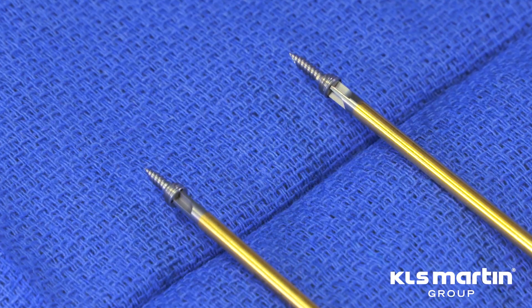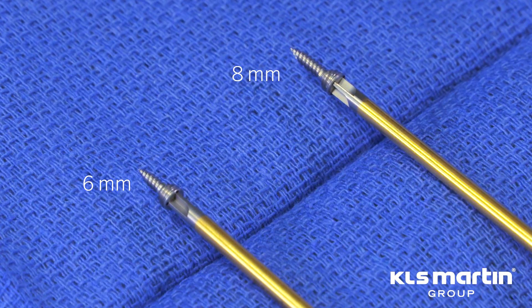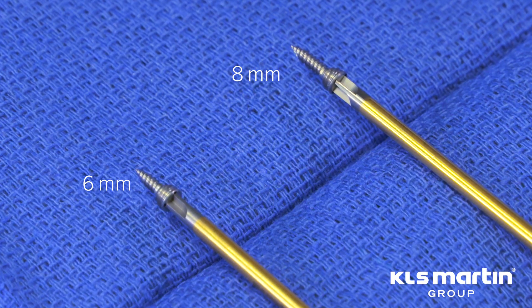Securing the L1 MMF arch bar to the bone is made simple with the choice of drill-free thread locking screws with six or eight millimeter bone threads.